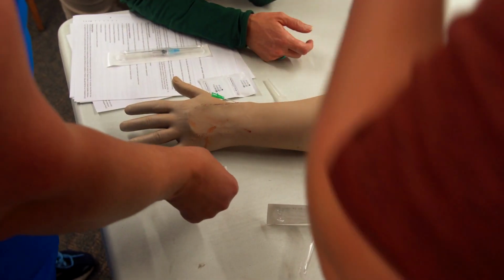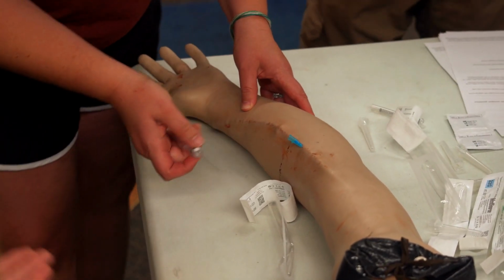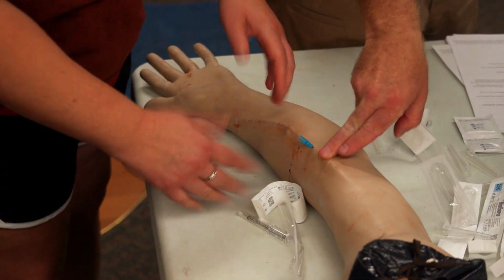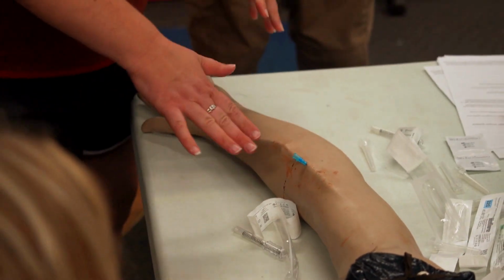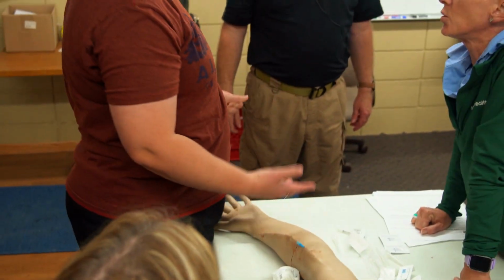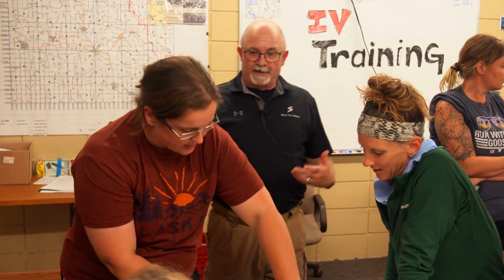Getting that in, your angle comes way down, but you're still, you have this on, right? Sorry, that was perfect. It was A+, I would say, except for tamponading off. So if you forget to do that, blood's going to start pouring out. It'll remind you. Yeah, I'll see it once.